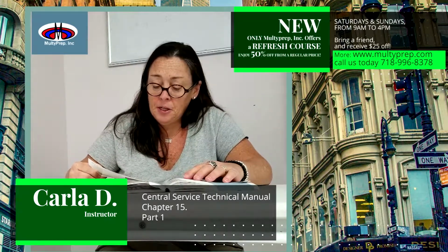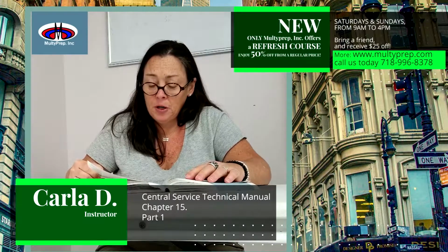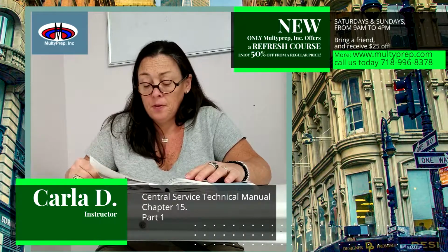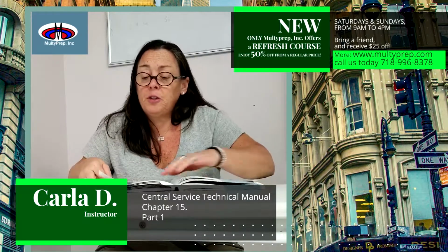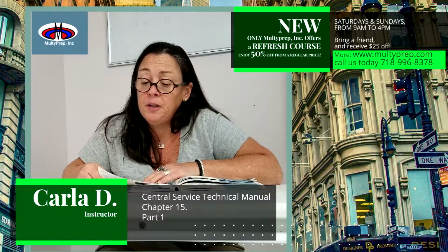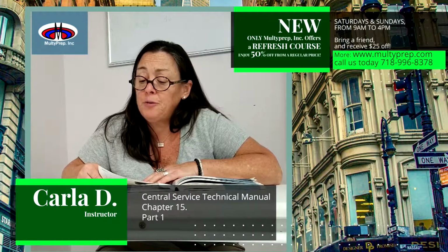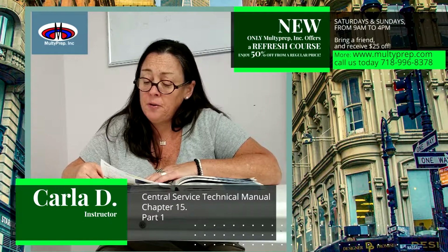Safety. ETO is a toxic gas classified by OSHA as a carcinogen and a reproductive hazard. To protect central sterile technicians, ETO sterilizers should be located in a well-ventilated area with a room air exchange rate of at least 10 changes per hour. The sterilizers are usually installed in negative pressure rooms with contained ventilation systems venting to the outside. See figure 15.5 as an example of ventilation of negative pressure room.